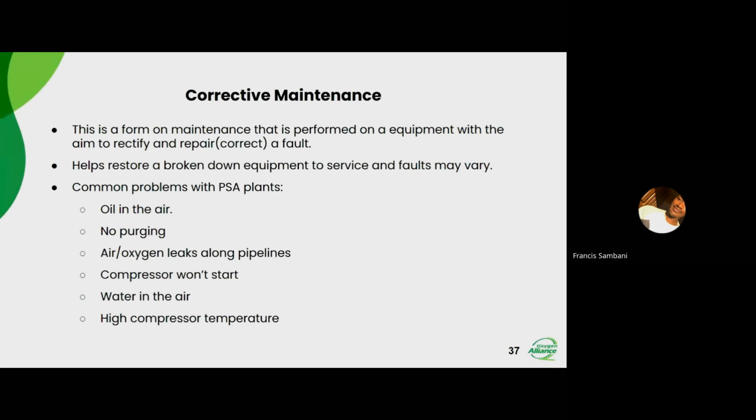In our case, for example, we had this problem. We didn't check out those two, but what we did change was the last eco-drain, not the air dryer eco-drain. Eco-drain is just short for electronic condensate drain. We changed that, and that solved our problem. Not only that, we also changed the three coalescing filters that we have. So that got rid of our problem. You can try either checking that side, or also checking these three.